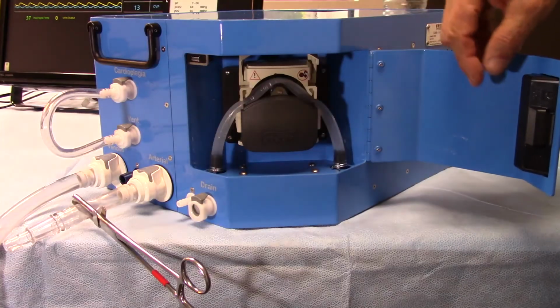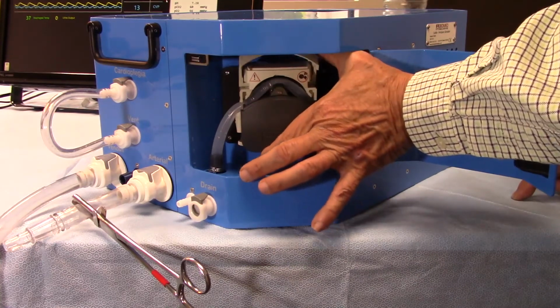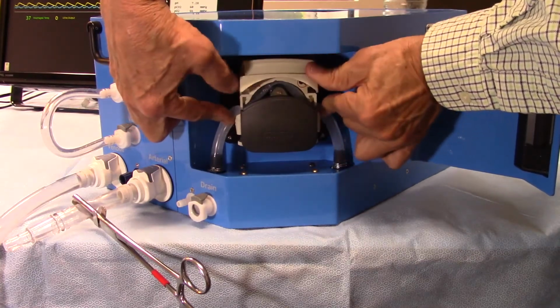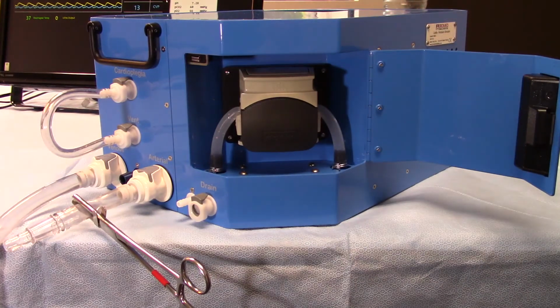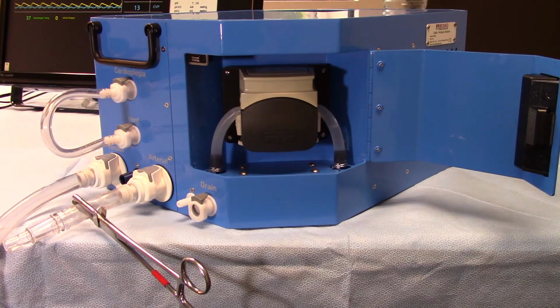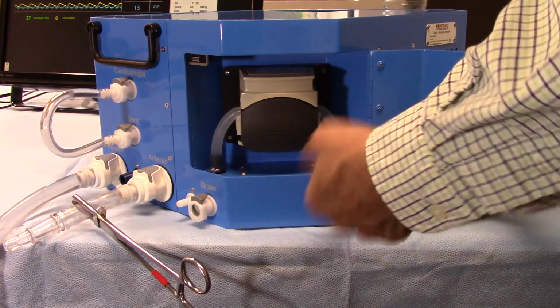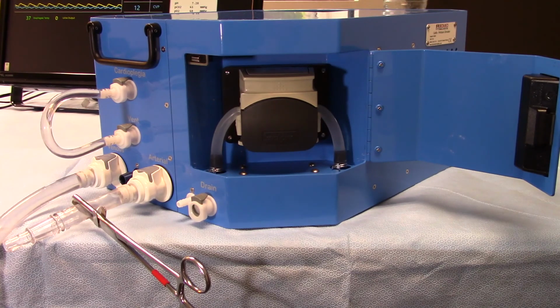What we're going to do now is prime the heart pump. One of the things that we'll notice is that there's a top on it that has to come down. I like to push the edges of the tube back and cock the pump in this way. Once that's down, then we're going to go ahead and turn on the pump, which gets it going. And what it's going to do now, pump some water through and prime itself in this way. So we're going to let it go until all the air seems to be out. It might not be real fast, but just let it go, and eventually all that air will disappear.